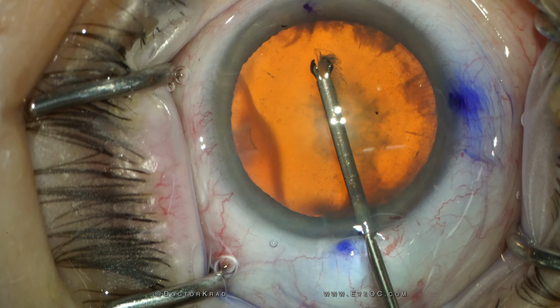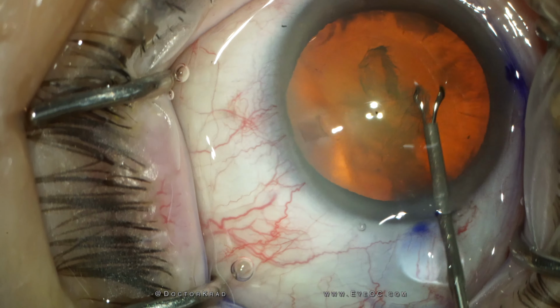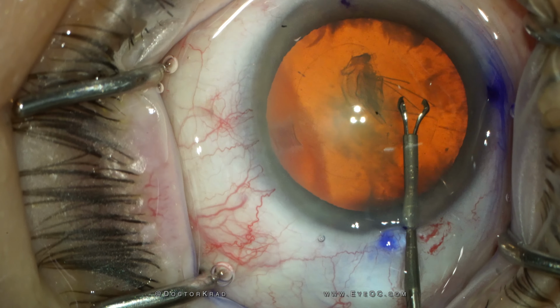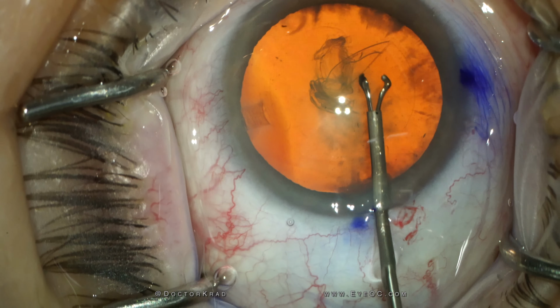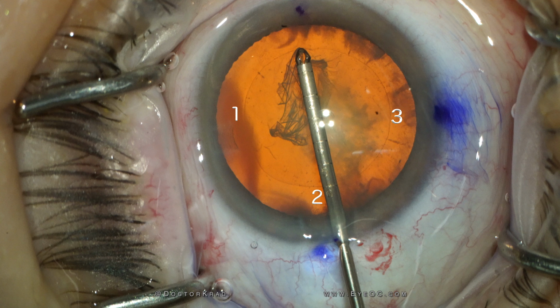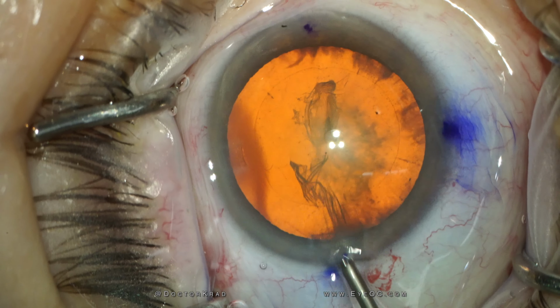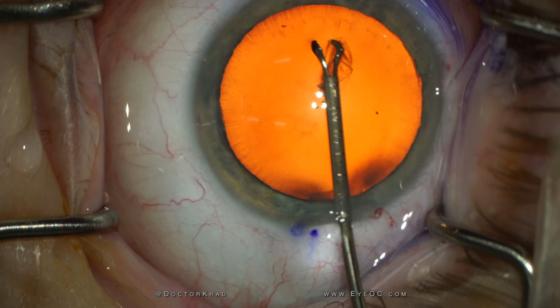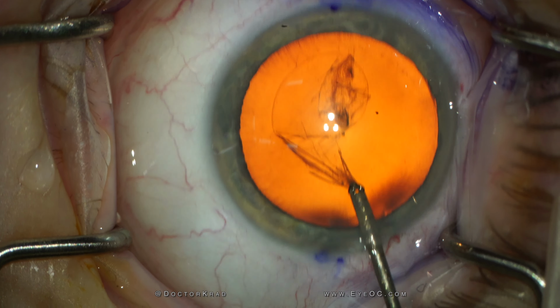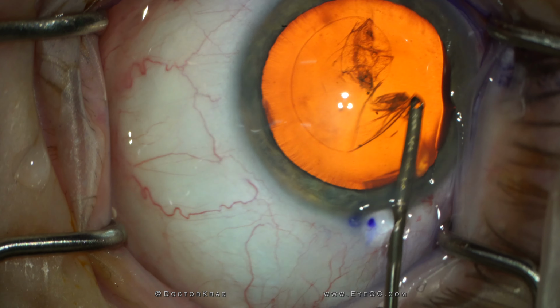When I perform a RHEXIS, I don't routinely use a corneal marker or mark the lens. I'll let you know what works best for me. And keep in mind, once you do this enough times, you don't have to think about it. It comes naturally. I focus on only 4 points of the circle. These points are a priority for me. I feel like if I can master these 4 points, the rest of the RHEXIS will be great. The left point, the bottom, the right point, and the top. Or in this video, I'll put it as west, south, east, or north.